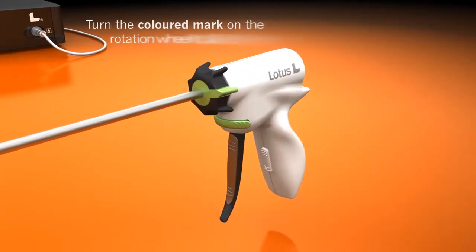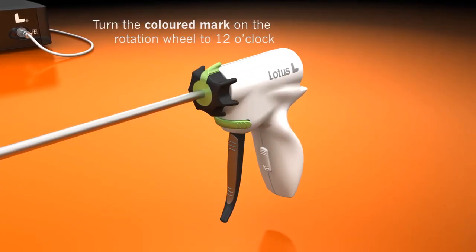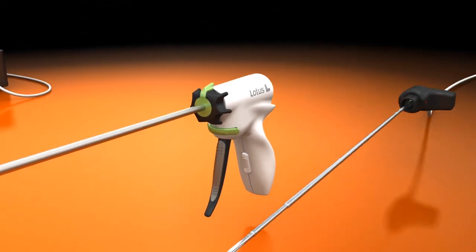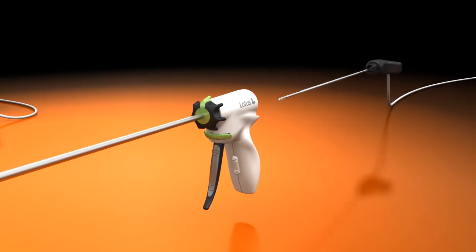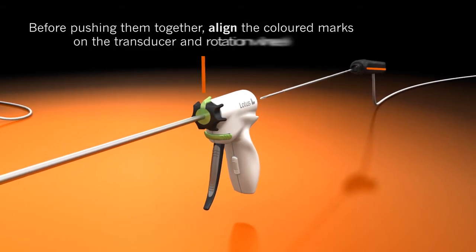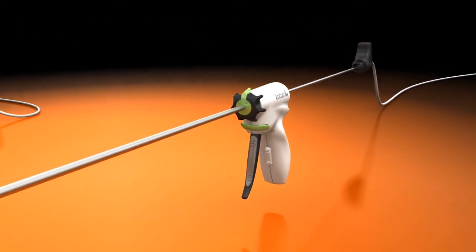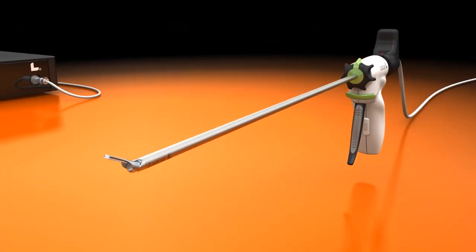Turn the coloured mark on the rotation wheel to 12 o'clock. Open the jaw of the handpiece. Ensure that the coloured marks on the transducer and rotation wheel are aligned. Push the transducer and handpiece together until the stop.